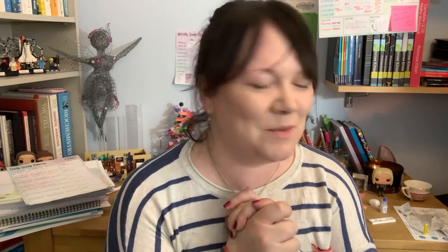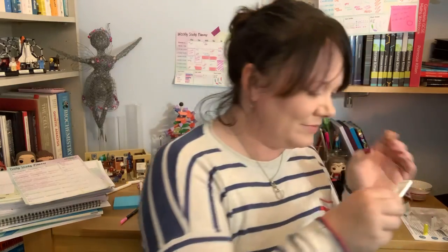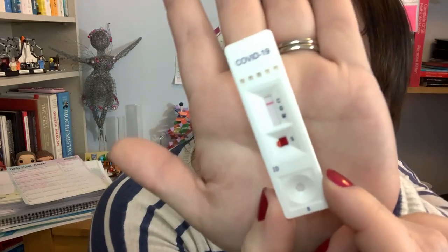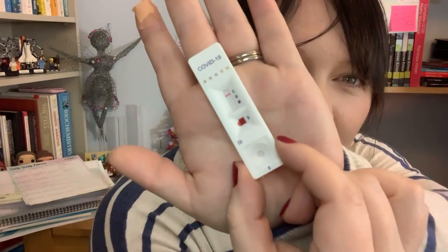Positive or negative? I don't know what to think. It is negative. Here we go — the C is the control, so that tells you the test is working, and the IgM and the IgG will tell you the antibodies. But there are no lines there, so it is negative. So I have not had COVID-19.